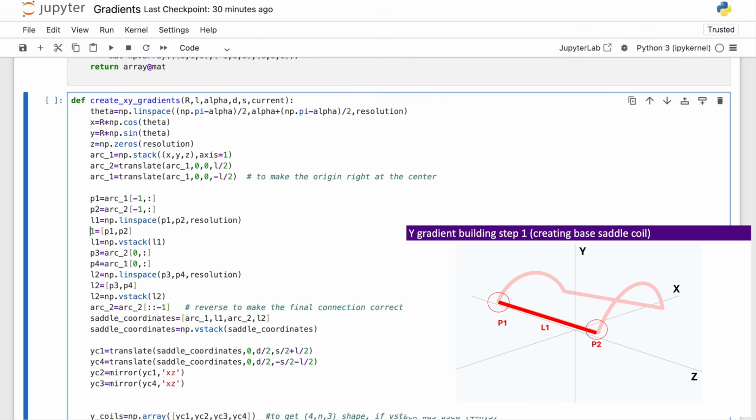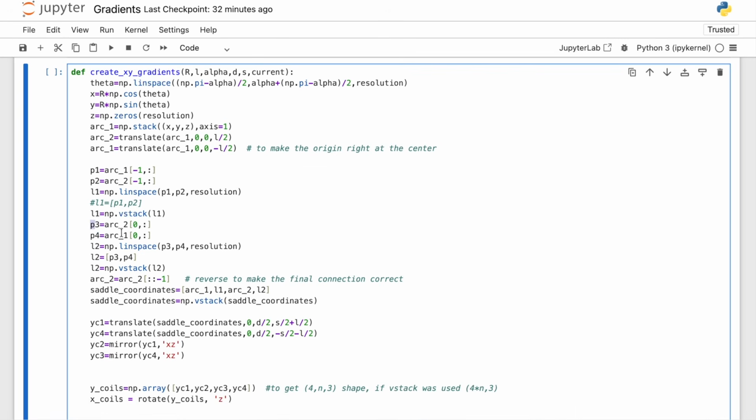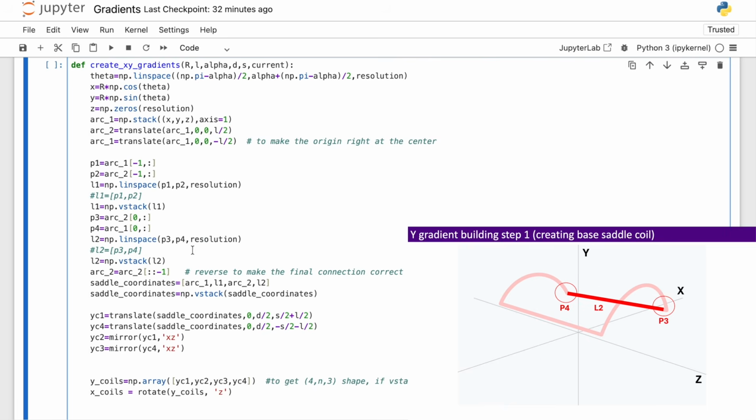So now let's comment the bottom part, because we'll first visualize, then use the Magpylib. So then L1's coordinates are a vertically stacked version of the L1 which we just defined. Similarly, point 3 and point 4 are the first points of arc 1 and arc 2, which are again connected together with line 2. And we have two definitions for line 2, with linspace and just an ordinary array of 2 points. So for now I will comment the 2-point version.